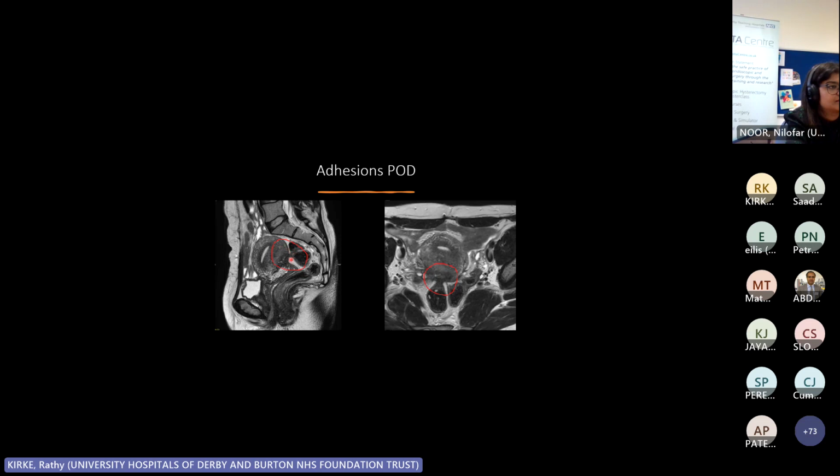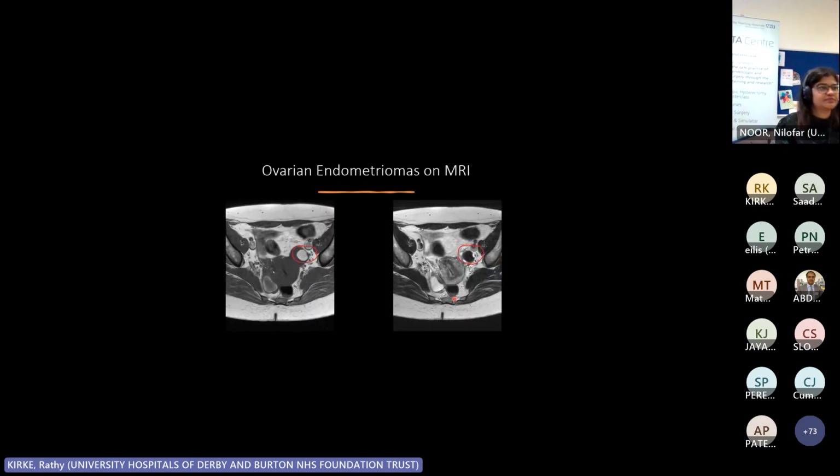You can see this big band. You shouldn't see bands. You should see fat going all the way along the uterus with no dark bits in between. If you see these dark bits here, that is a big adhesive band between the uterus and the bowel. That is deep pelvic endometriosis. You see the entire layer of mesorectal fascia thickened, fibrosed, and you see endometriosis starting to infiltrate that sigmoid wall, starting to pull it anteriorly, starting to push the uterus posteriorly. Those are all the adhesive infiltrative bands of endometriosis that develop at every cycle, every time these glands reactivate.